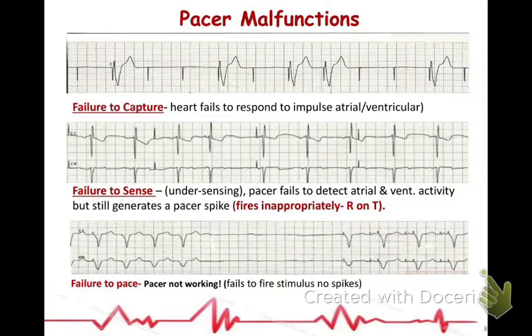And then you have your failure to pace. That means the pacer's just not working. As you can see, you've got a long line there with nothing.